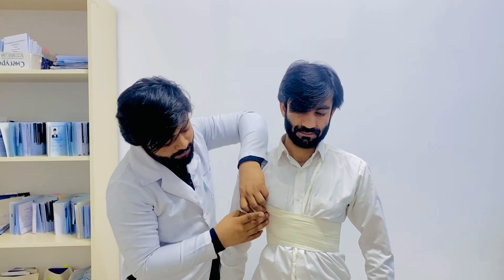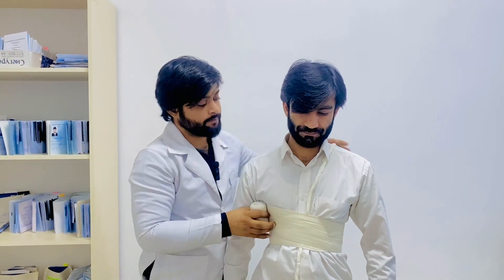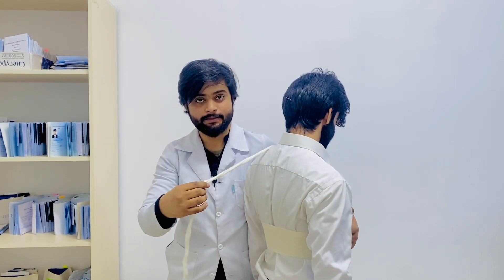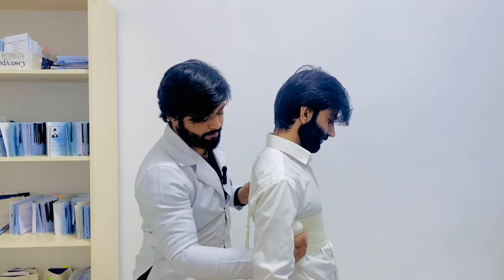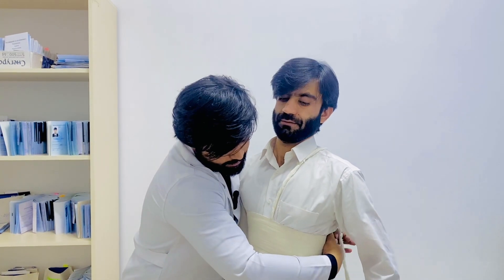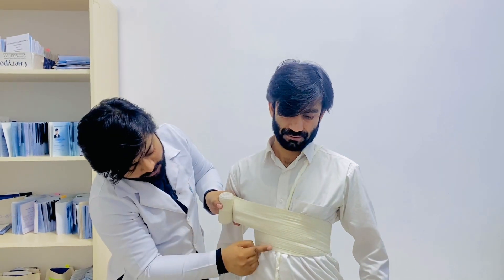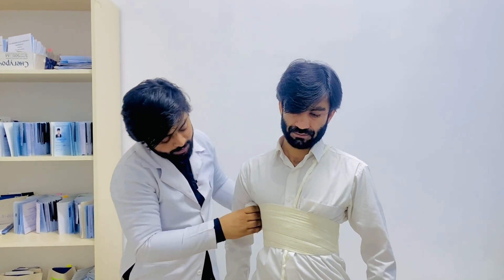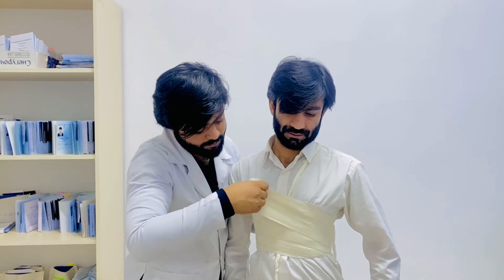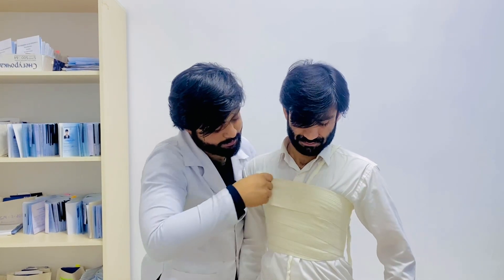Remember one thing: from the anterior side we are covering this area, but from the posterior side we are not covering this. So just make the spiral circulations — each circulation a little bit up from the previous one — and cover that side like this.